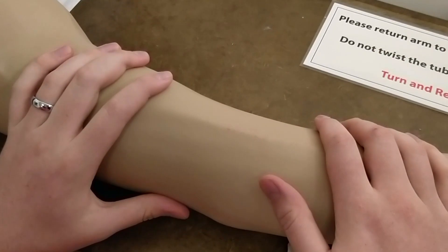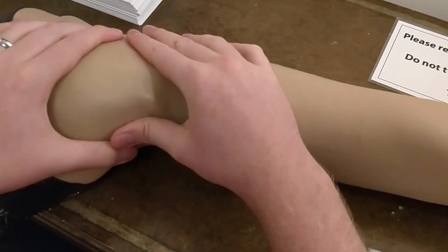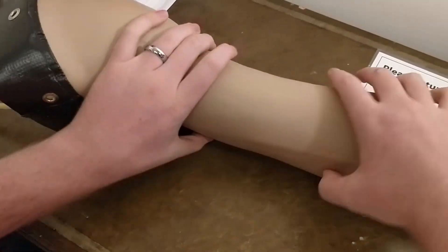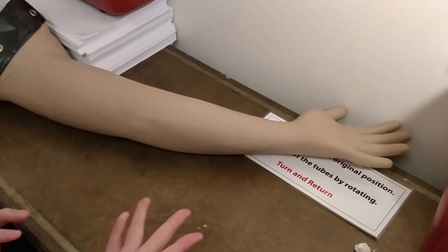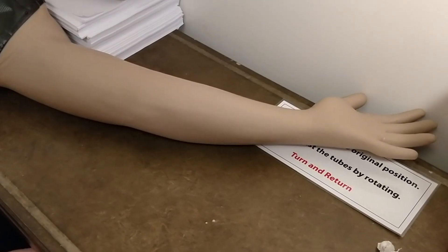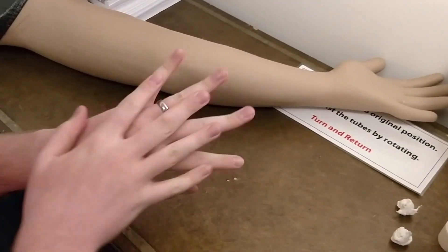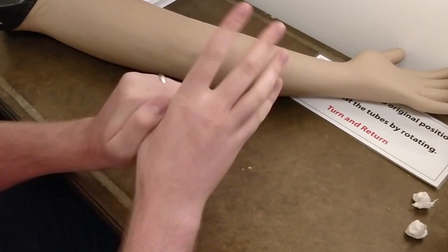This is the IV arm, but we can't really do an IM injection on it. For the sake of demoing it, we are not going to be injecting into the arm — we are just going to pretend that we stick the needle in and inject. First thing we want to do is greet the patient: 'Hello Mr. Lee, my name is Candidate 12345 and I am here to administer your fluorescein angiography.' Then wash our hands for 20 seconds, making sure to get the back of the hands, in between fingers, under the fingernails, and importantly the backside of the thumb — a lot of people forget that.